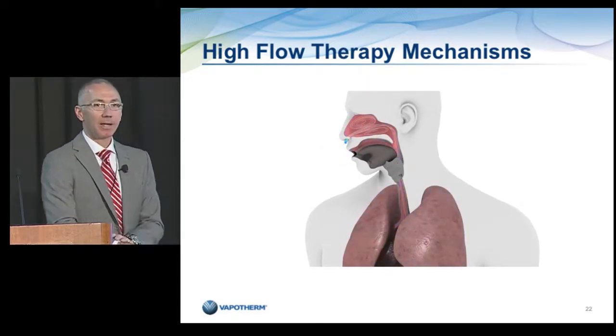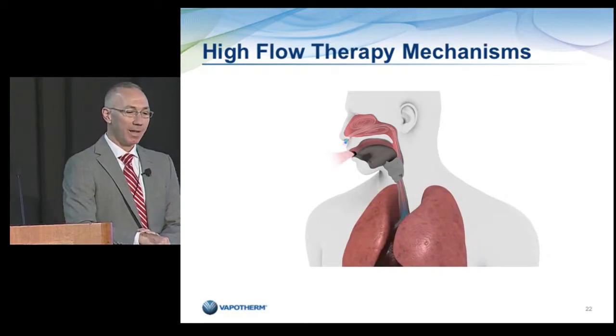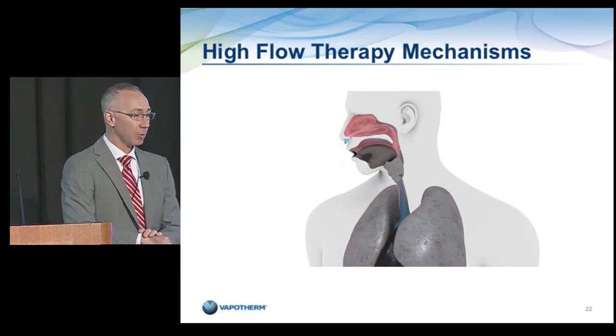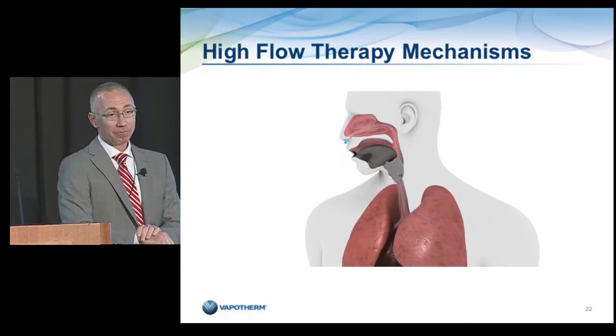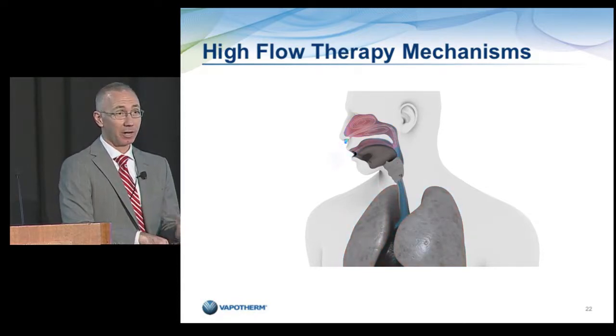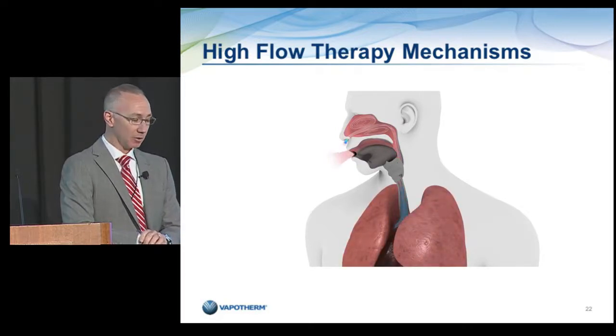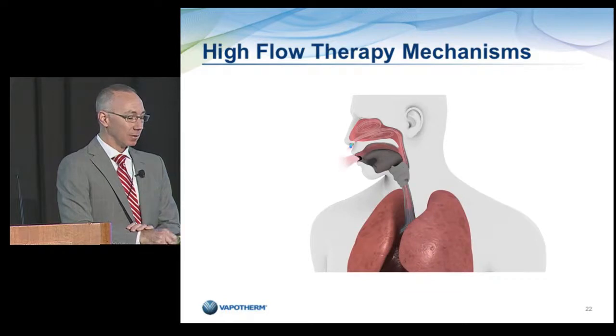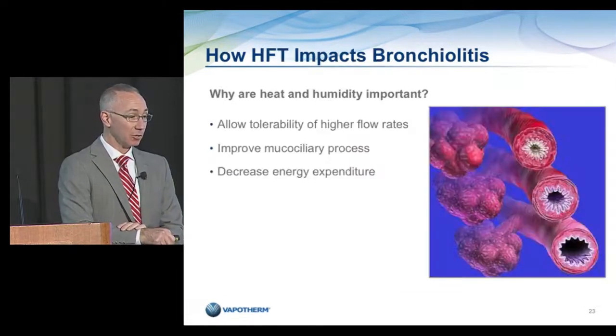You can do that, and by that I mean apply high flow of medical gas into someone's airway, mostly because it is fully heated and humidified. So the gas has to be perfectly conditioned for you to do that. If you try to blow 20 liters of flow into someone's airway without proper conditioning, very quickly that mucosa will cool, it will become hypersecretory, it might dry. So you need the proper conditioning for that to happen. So the Vapotherm device allows you to do that.